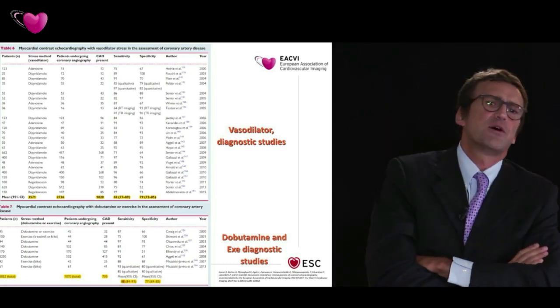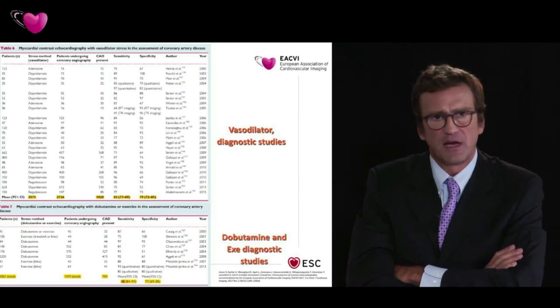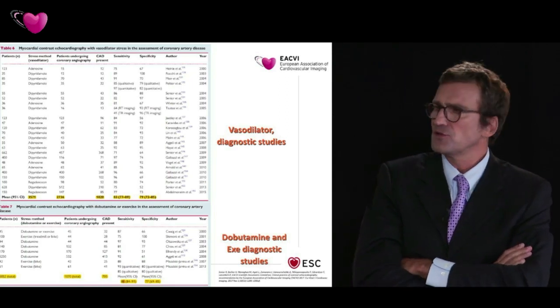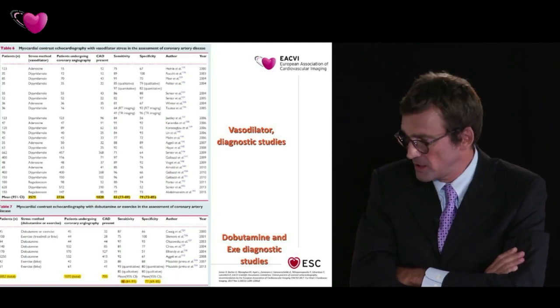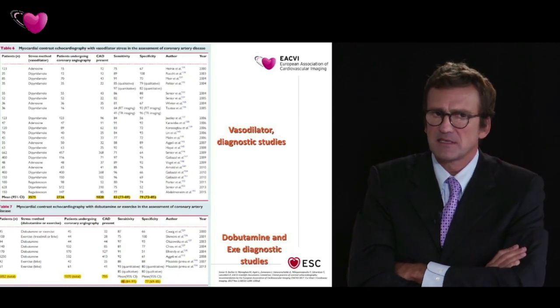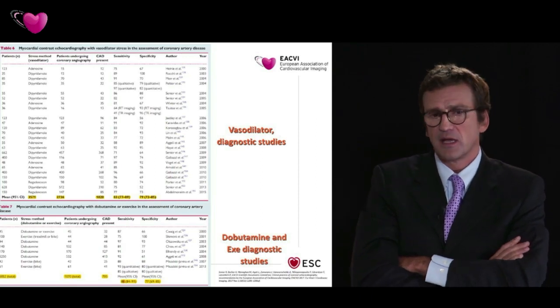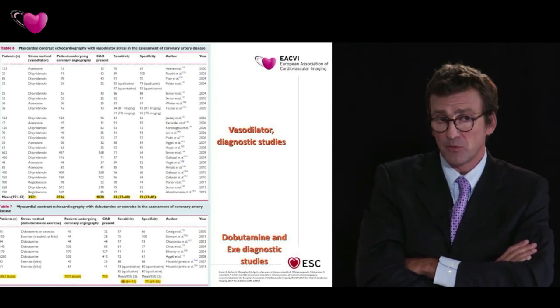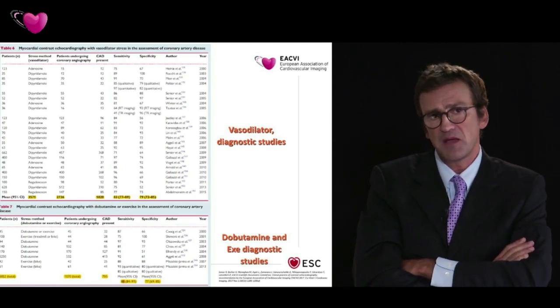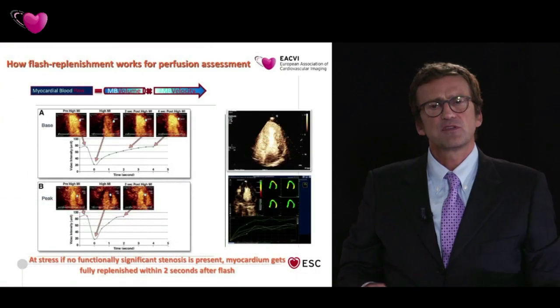Yes. So vasodilator, dobutamine, and exercise stress echo studies are there to be read. There are almost 4,000 patients for vasodilators, and it's dipyridamole, adenosine, or regadenoson lately. And dobutamine, atropine, and exercise studies have also been made, all demonstrating that sensitivity is very good, approximately 80%, a sensitivity which cannot be reached without contrast and perfusion, but specificity may be similar or slightly lower, because that's the balance.